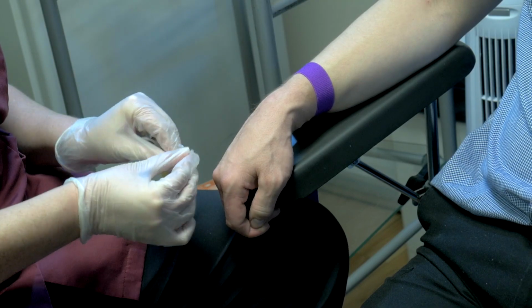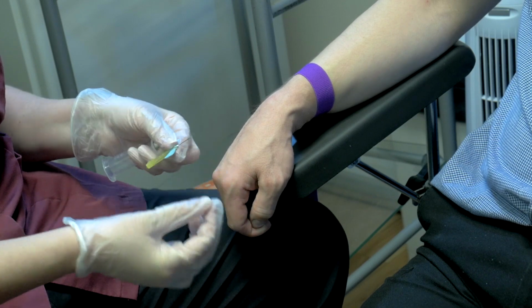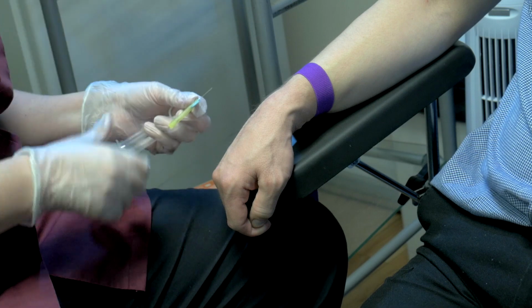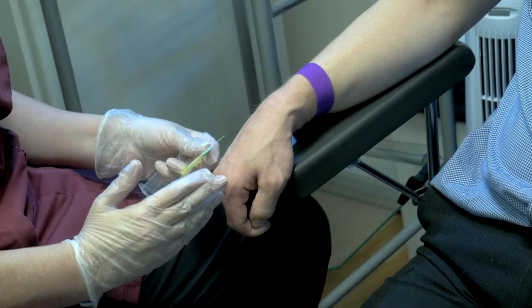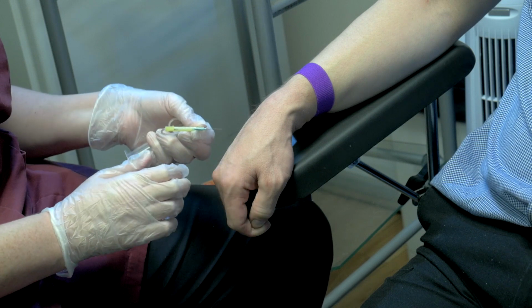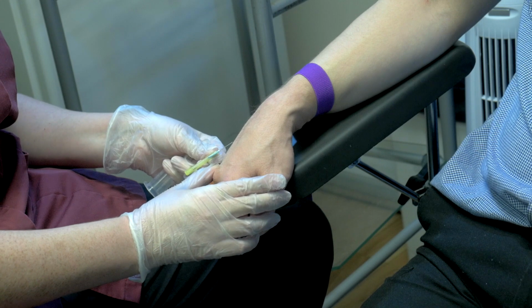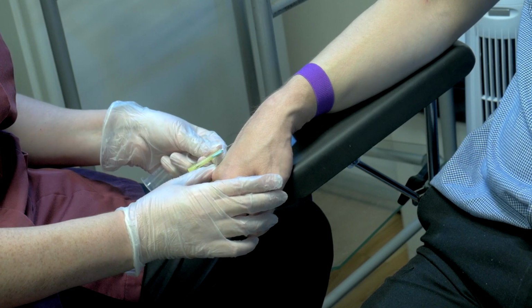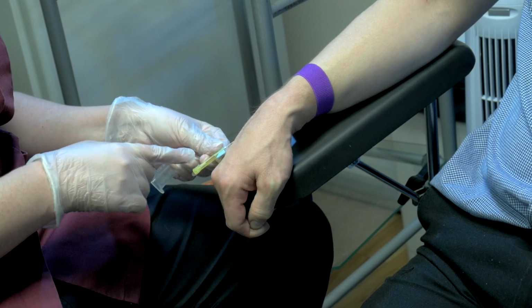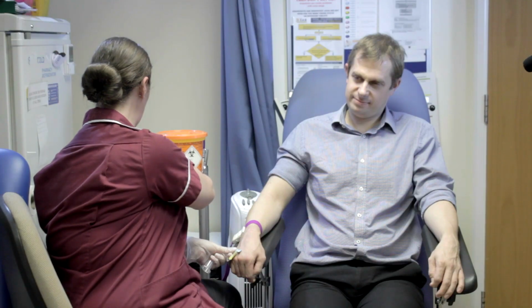Then I'm going to give this a really good twist, because these can be quite difficult to take off. So I want to really make sure it's nice and loose. And then I'm going to skim upwards and into the vein. It's not a steep one, it's just a skimming through the skin and into the vein. Sharp scratch. And we can see I've got some flashback there. So we know we're in the vein.